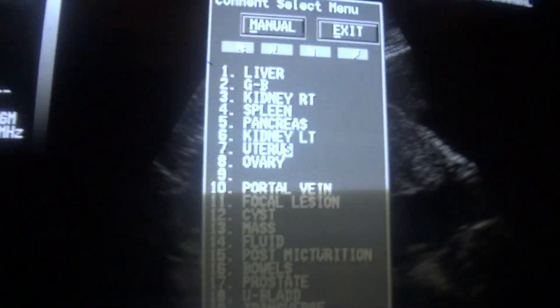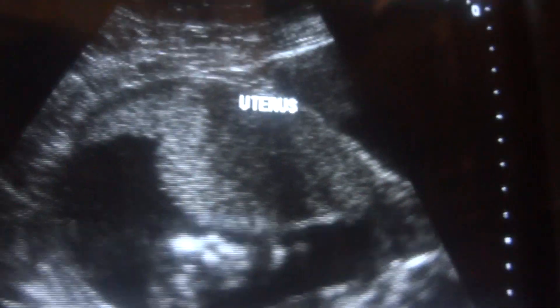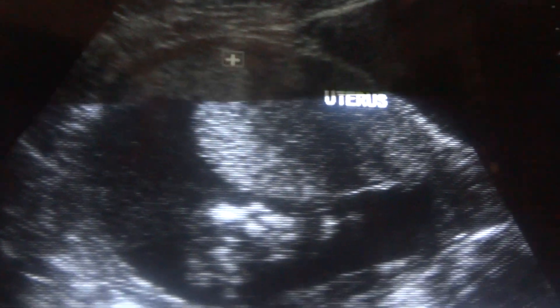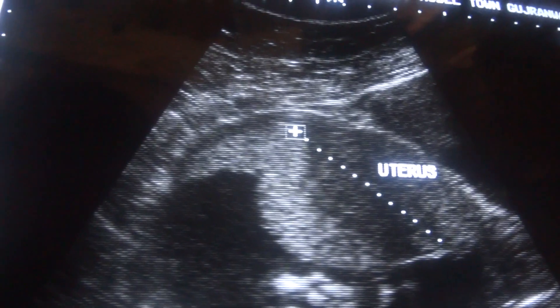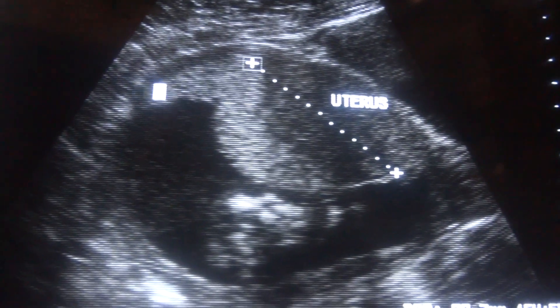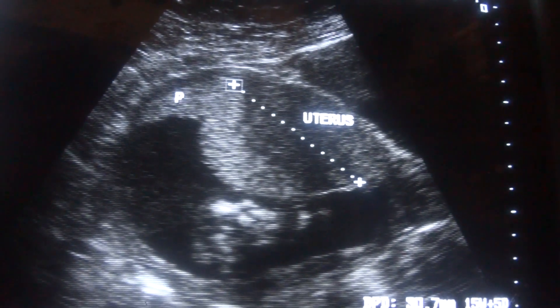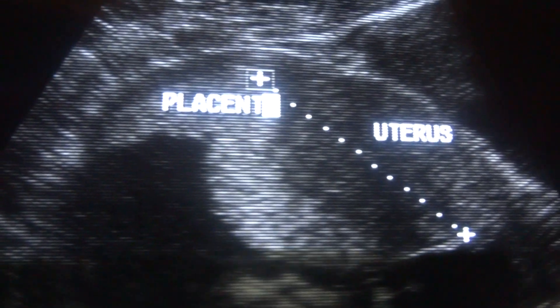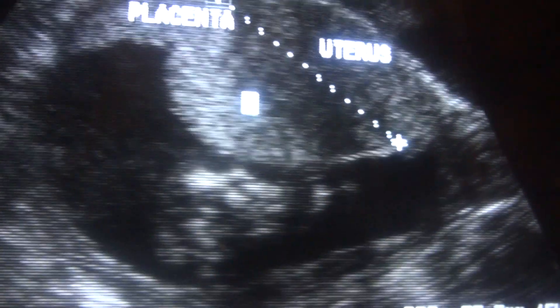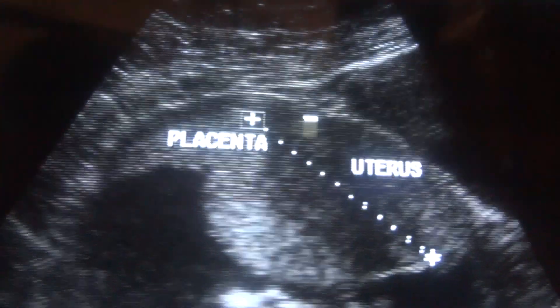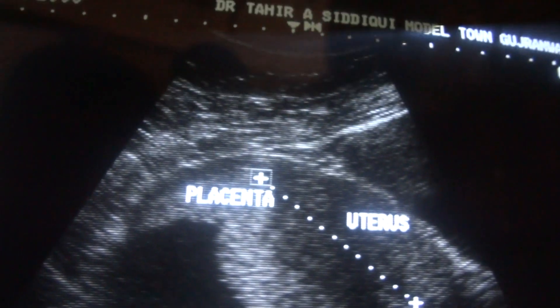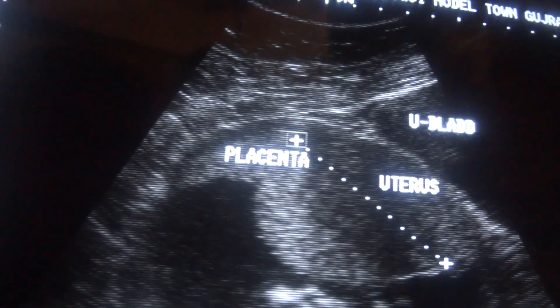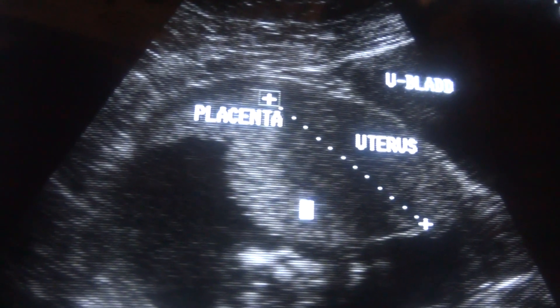This is the uterus. This area is that of the uterus. The cutoff point is here. This right part — this is the placenta, grade one. This is the placenta, and this portion is that of the anterior wall of the uterus. And this is the urinary bladder.